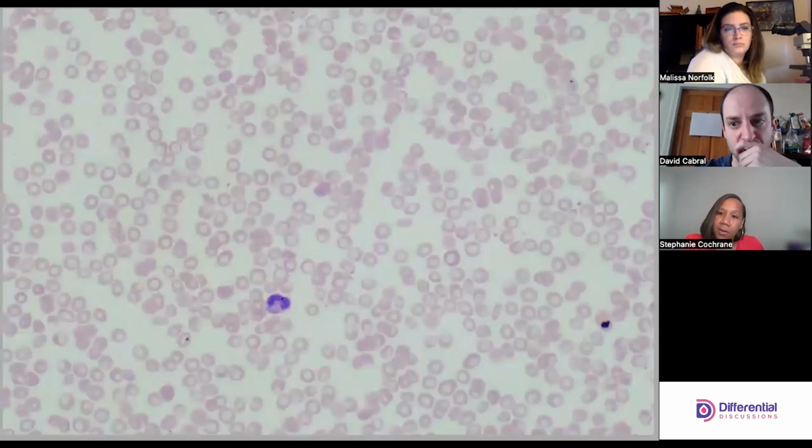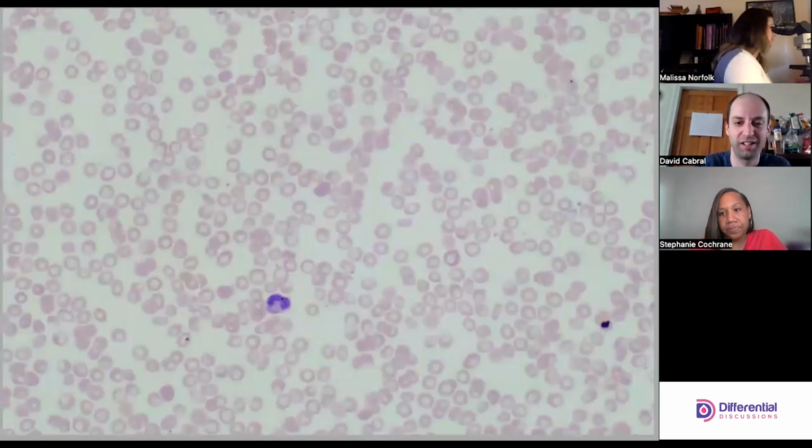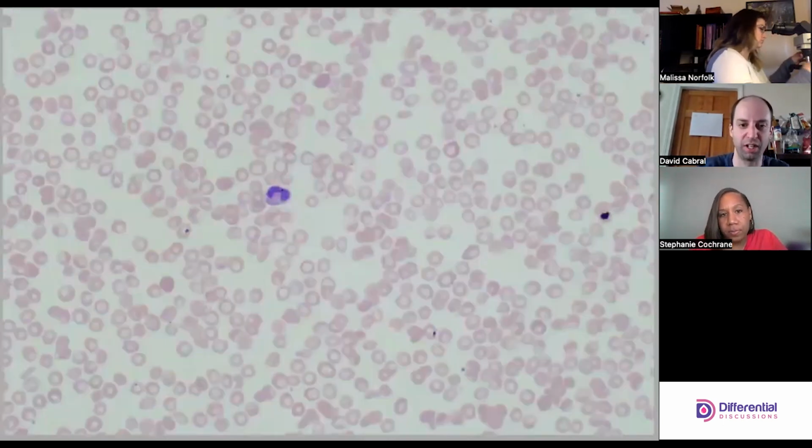Now, if the neutrophil count had been higher, the band would have been a little bit more concerning to me. But the fact that it was 63% lymphs, I don't think it is bacterial related, even with the presence of the band. It's a fair point. You want me to move around or go down? I wouldn't mind looking at that neutrophil just a little bit, and then maybe we can start cruising around a little bit more.